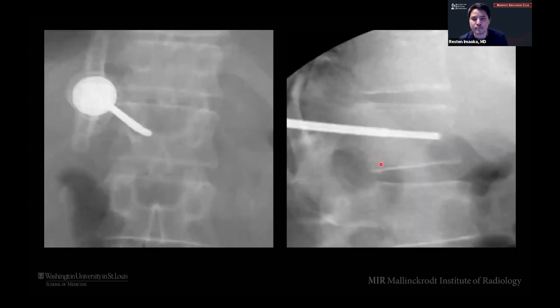cross midline. In this particular example, this vendor has a curved osteotome. So here you can see we're coming in, the osteotome actually curves across midline to make channels for the radioablation probes, right? So this one, on the very distant one, we actually don't want to cross midline, we kind of just want to meet it in the midline.